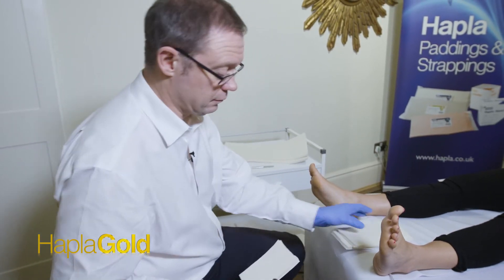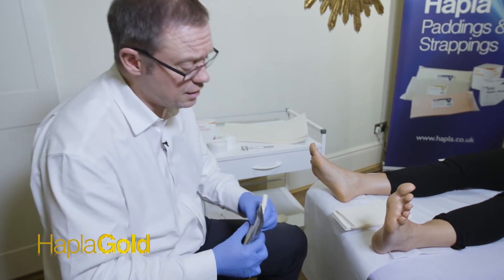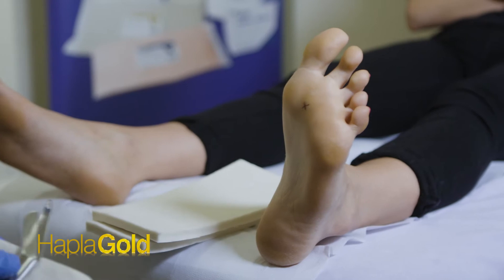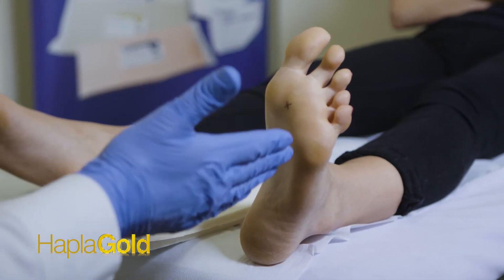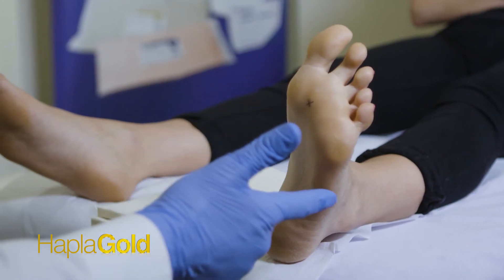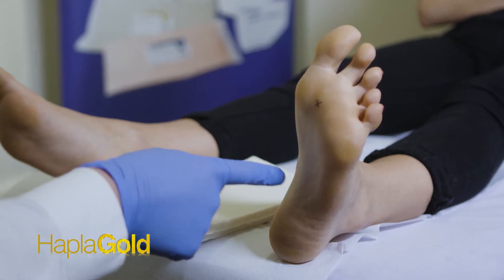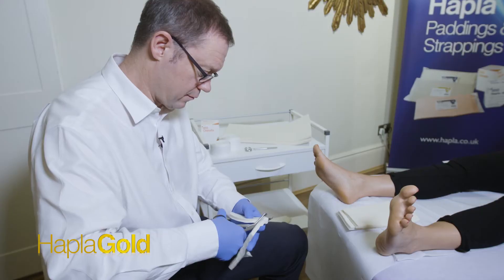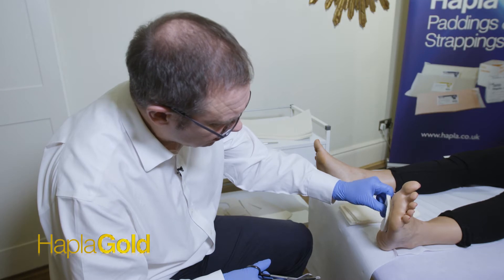First of all, making sure the foot is clean and the skin is nice and dry. We're going to cut the valgus filler. This will fill the area over the medial longitudinal arch; it will sit just proximal to the first, second and third metatarsal heads. It won't cover the fourth and fifth metatarsals and it will exit at around about the area of the spring ligaments. So we cut that first, and this sits in here.